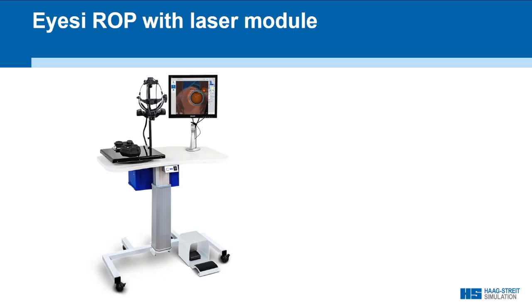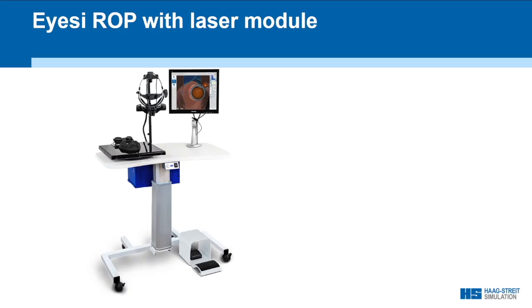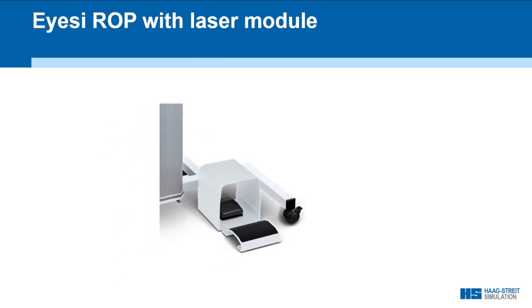So here's ROP with the laser module. And in case you don't see a difference, the only visual difference from the hardware side is the laser foot pedal.